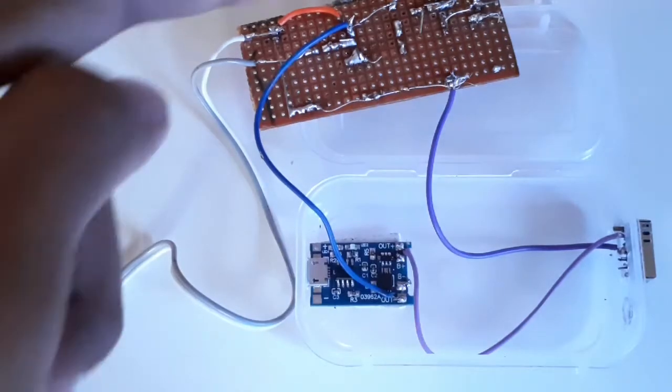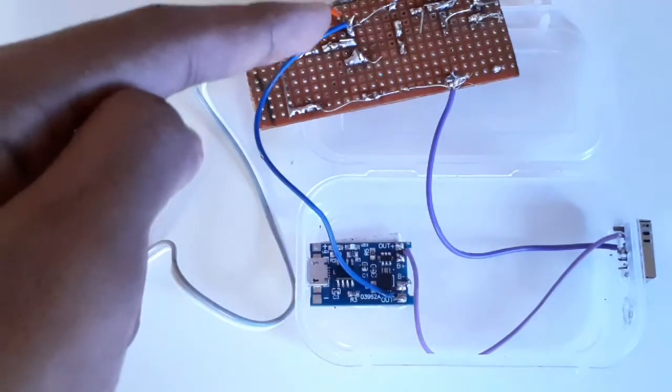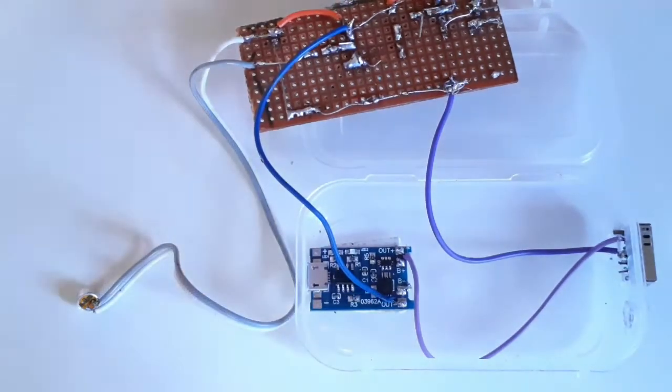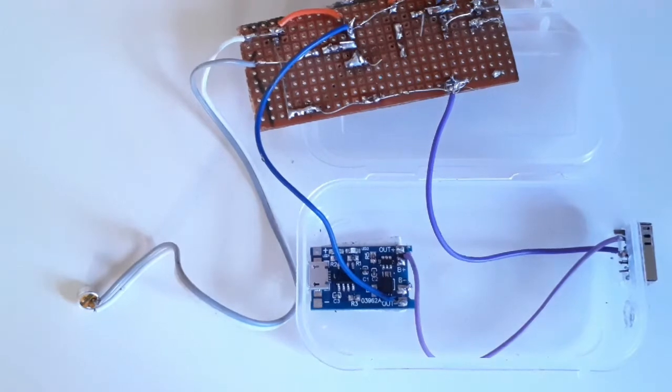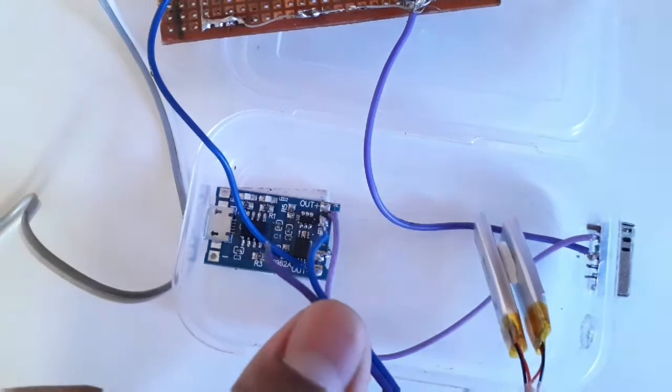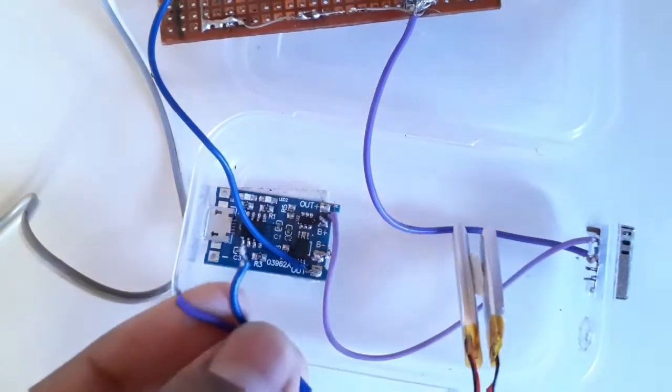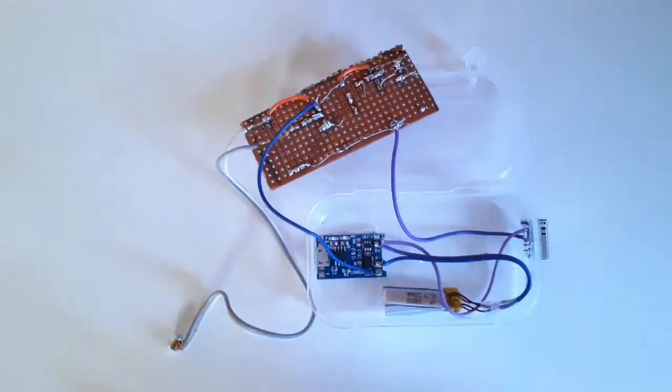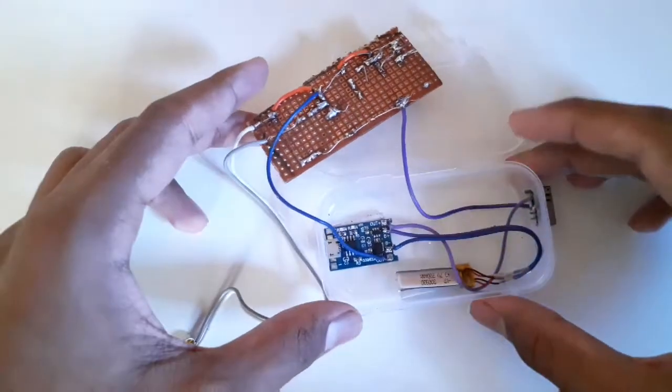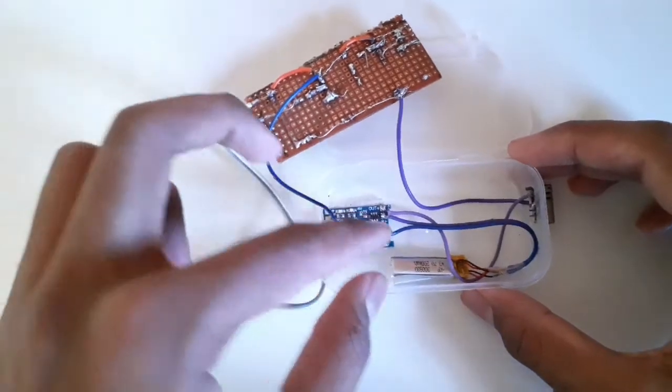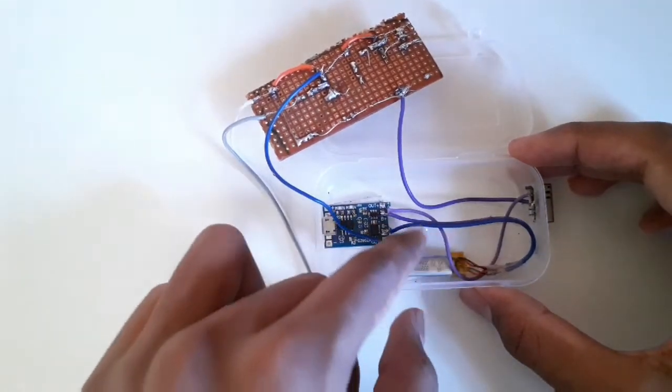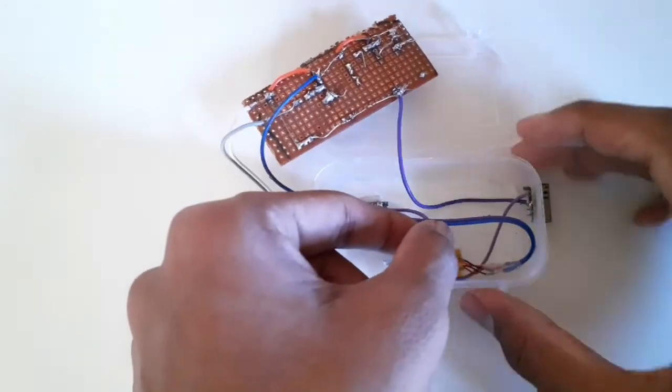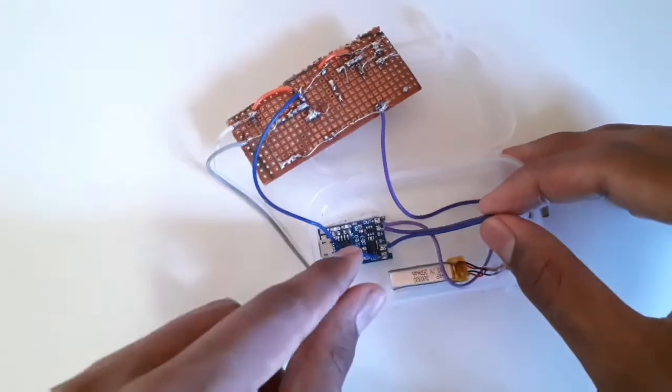Then we'll solder a wire from the negative output of our charging board to the amplification module's negative power input. And similarly, we'll solder the battery onto the charging board.